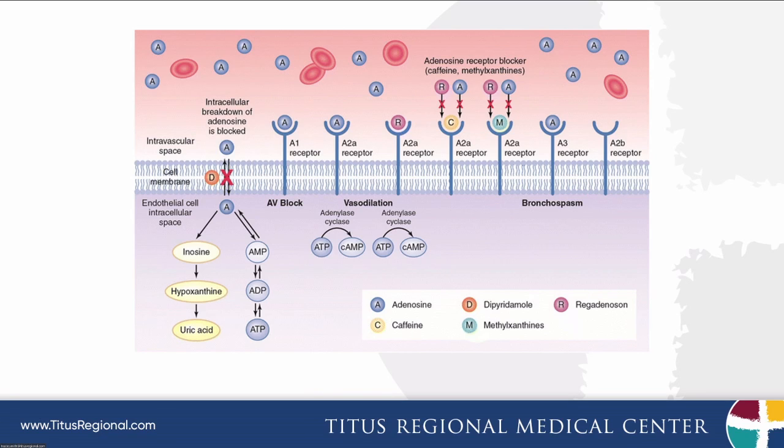There are other adenosine receptors that can bind to, which can cause high-grade heart block. And so again, in patients who have pre-existing heart block or bradycardia, we tend not to want to use these agents because they can exacerbate that problem during the test. Usually these things are all easily and quickly reversible, but we'd like to avoid them if we can.